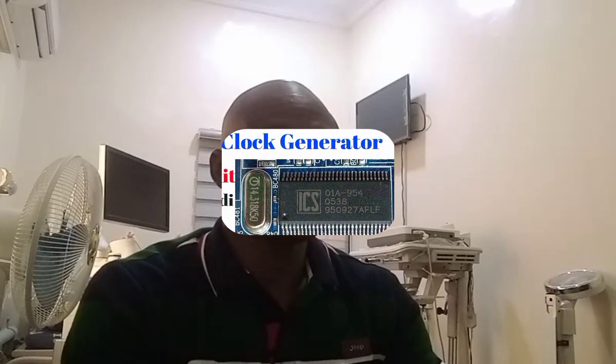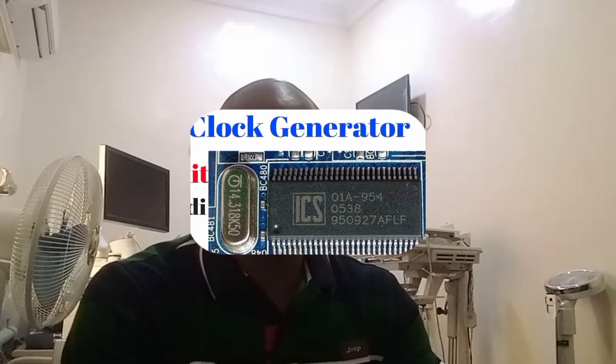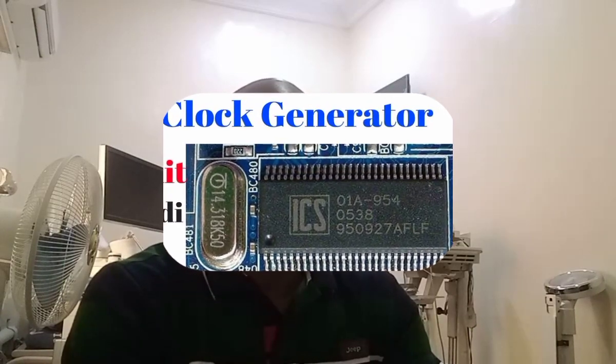So the clock generator, what it does is it controls the number of excitation voltage that is sent to the transducer. Now, this determines the PRF. It is also responsible for sending timing signals to the other components in the system so that each pulse echo sequence can be accurately timed.